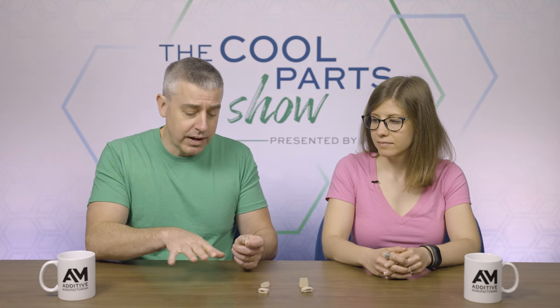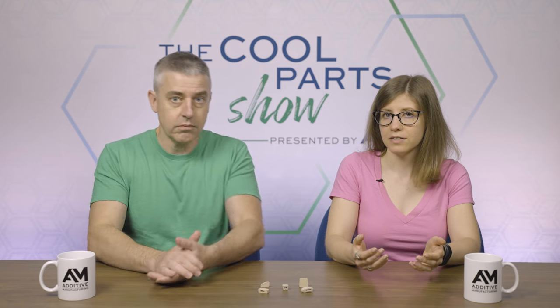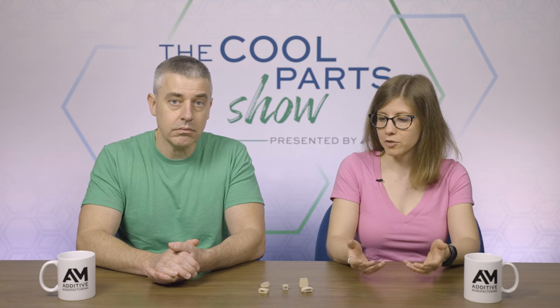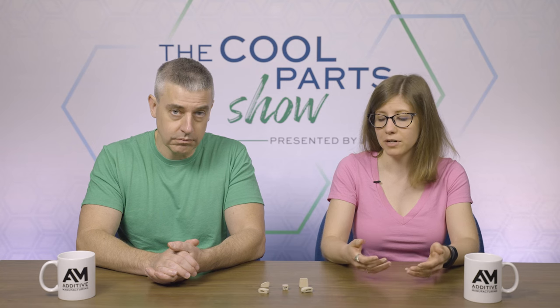Getting to a process that could build a part this way, that's what was involved in the invention of a new deposition process. Fused strand deposition works really well with PEEK because it's a path-dependent material. So the way that you manipulate the polymer during 3D printing is going to have an impact on that crystallinity, on the ultimate material properties. FSD is a way of controlling that directionality as well as controlling the cooling of the material. We figured out how to control that thermal history in terms of depositing this layer by layer.